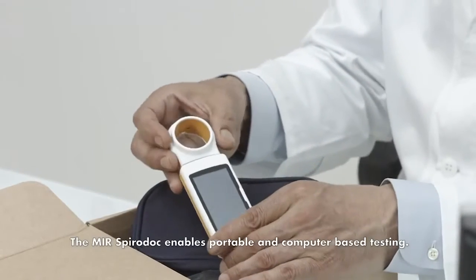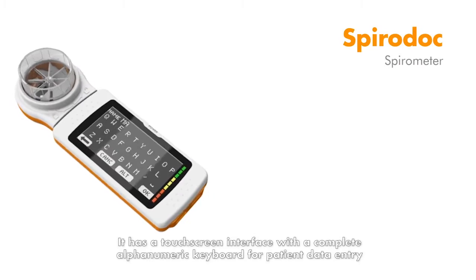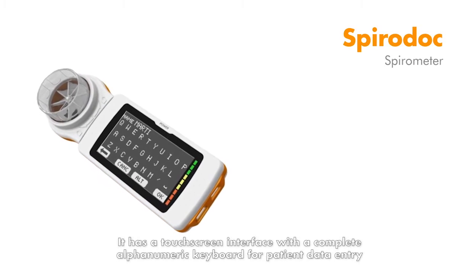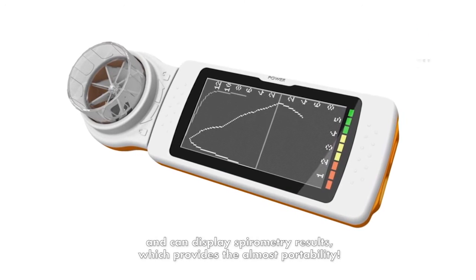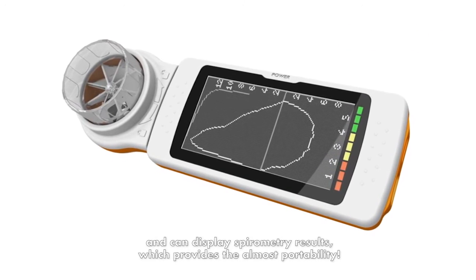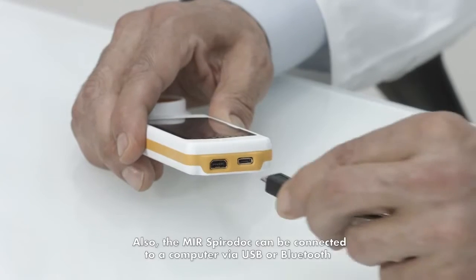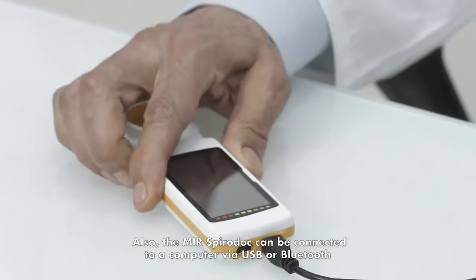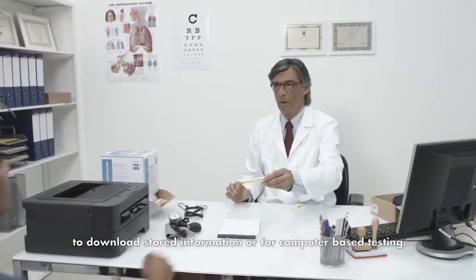The MIR SpiroDoc enables portable and computer-based testing. It has a touchscreen interface with a complete alphanumeric keyboard for patient data entry and can display spirometry results, which provides the utmost portability. The MIR SpiroDoc can also be connected to a computer via USB or Bluetooth to download stored information or for computer-based testing.